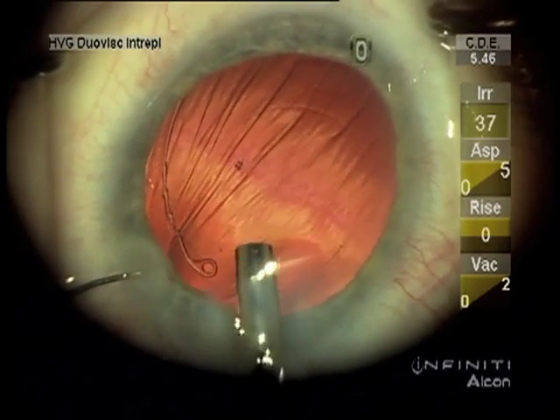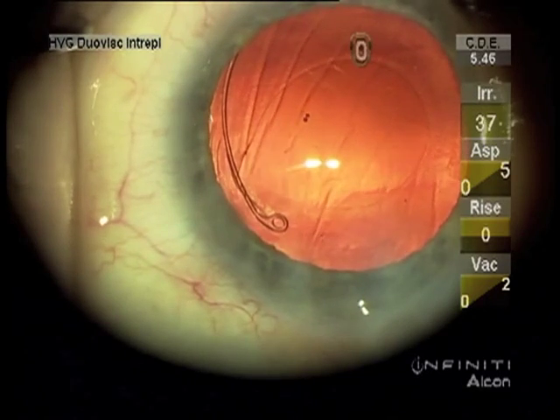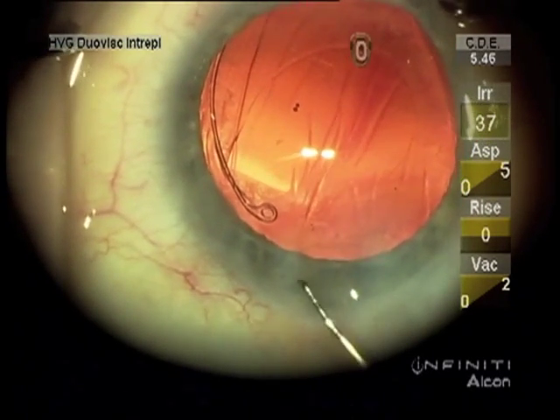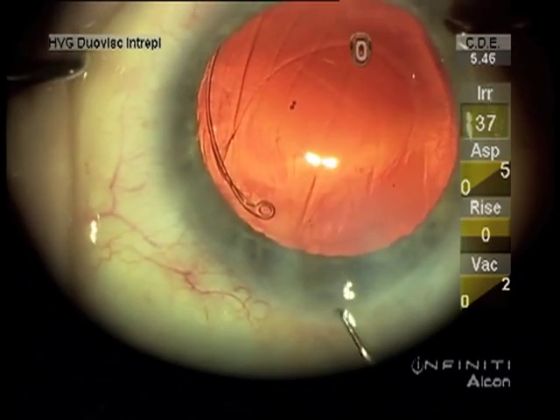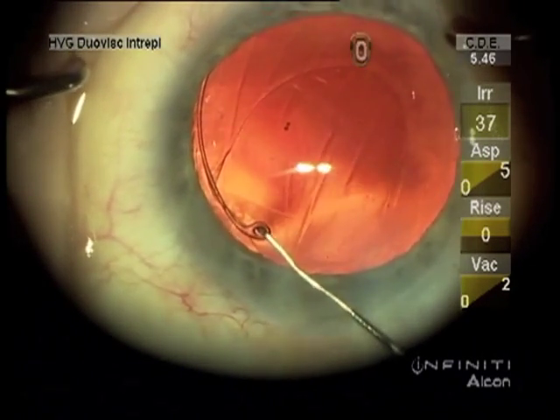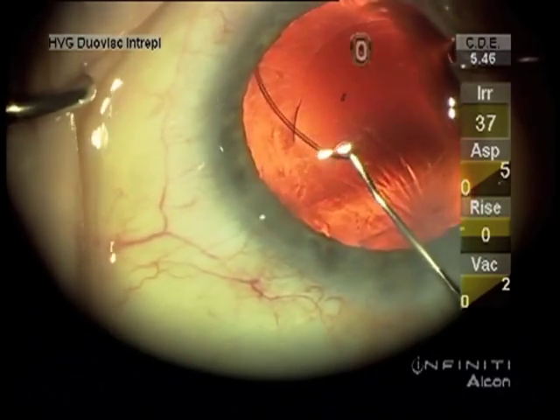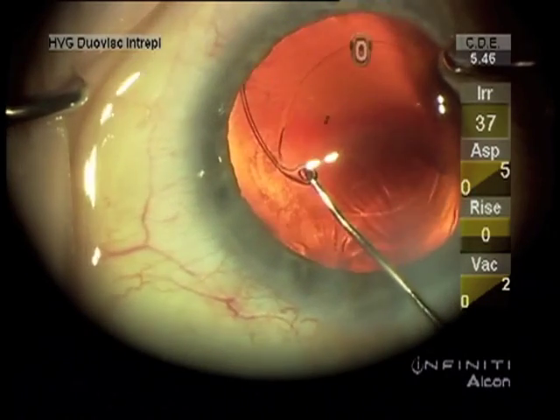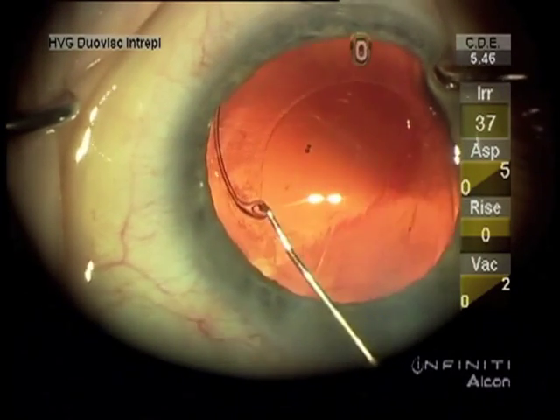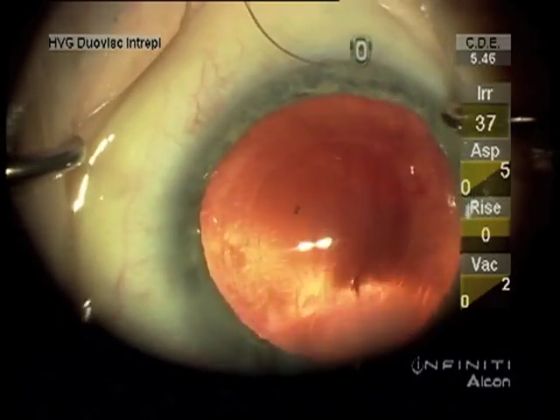Then you can leave your Sinski hook there to release the end of it from the injector. You can also use it, as shown here, if the end has not slipped into the capsule opening — you can see this capsule opening is rather small.